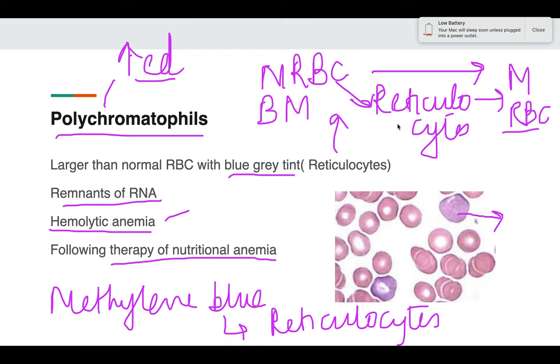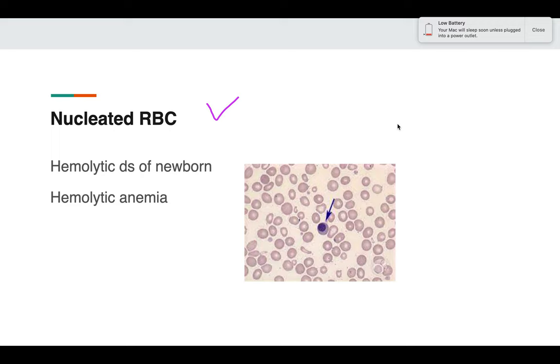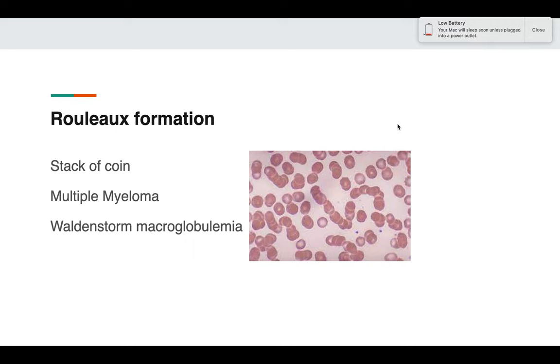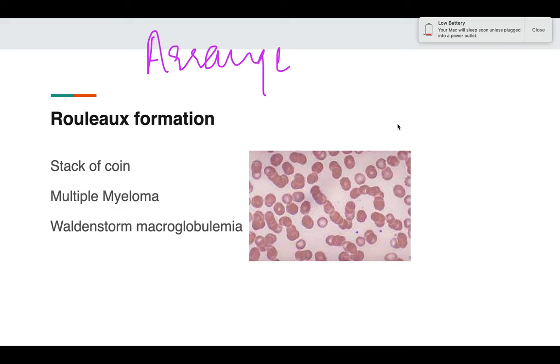Polychromatophils are also increased following therapy of nutritional anemia — for example, giving B12 to a patient with megaloblastic anemia or iron to a patient with iron deficiency anemia who is responding to therapy. The bone marrow generates more RBCs, so polychromatophils can be seen on the smear. Nucleated RBCs can also be seen in conditions such as hemolytic anemia and hemolytic disease of the newborn.